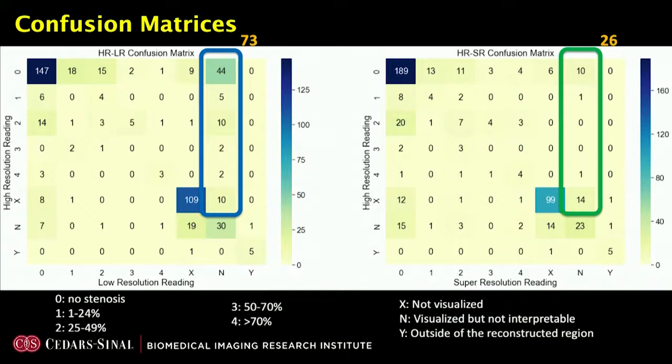And also, there are significantly higher number of segments that are deemed non-diagnostic with the low resolution data, where the number for super resolution data are much lower.